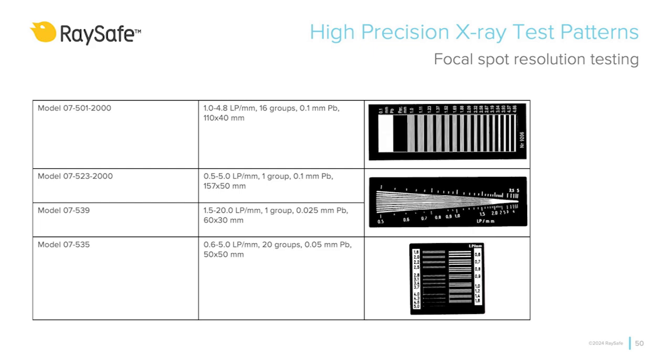Regular use of these phantoms ensures consistent monitoring of equipment performance, detecting any decline that might indicate the need for maintenance or calibration. These phantoms can look different, but all essentially have the same function. And this was the last slide of today's webinar.